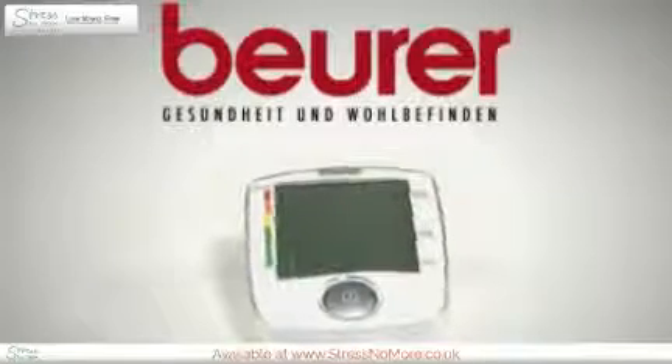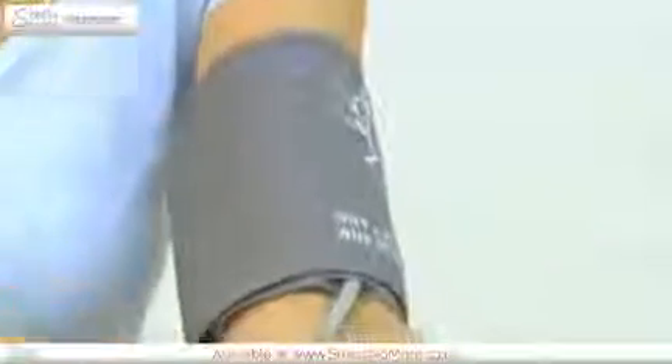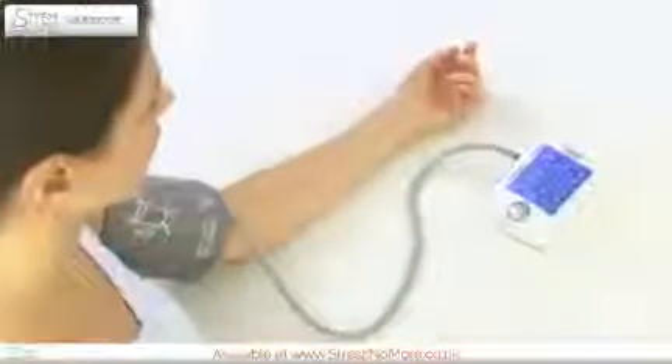Easy to use. Measure your blood pressure at home, simply and safely, with the Beurer BM44 upper arm blood pressure monitor. The BM44 excels through its easy operation. With just one button, the blood pressure monitor is ideal for taking blood pressure measurements at home.